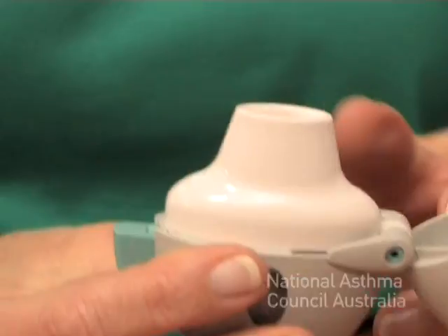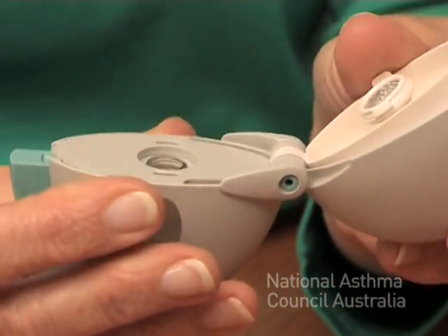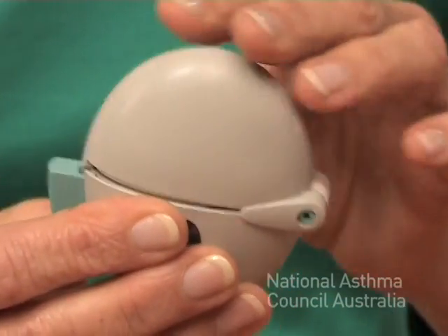Once you've finished, you need to remove the capsule by lifting the mouthpiece and throw that away. Close it all up and you're ready for the next time you need to use the device.